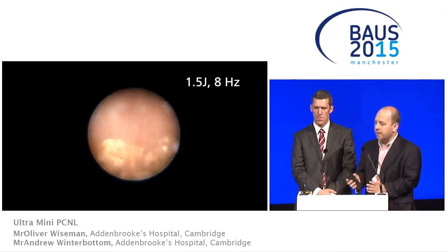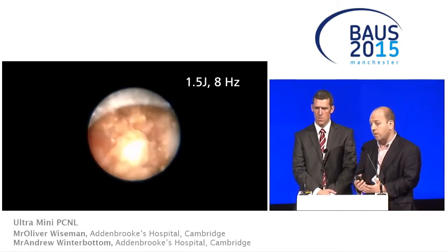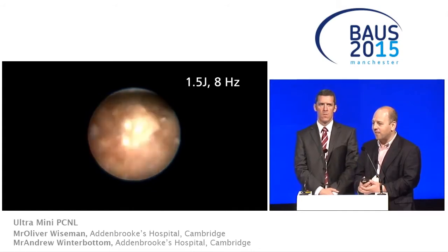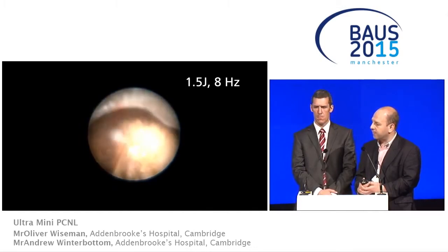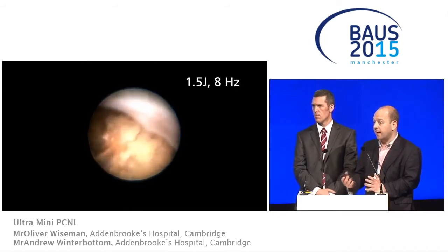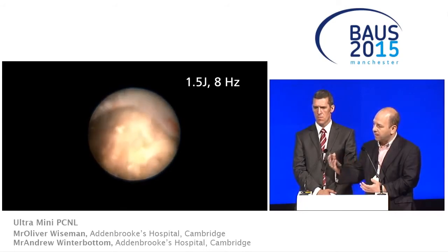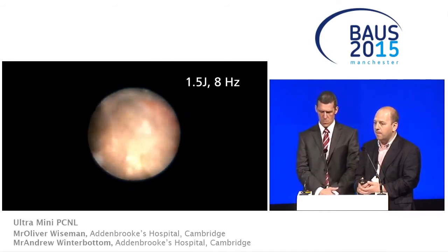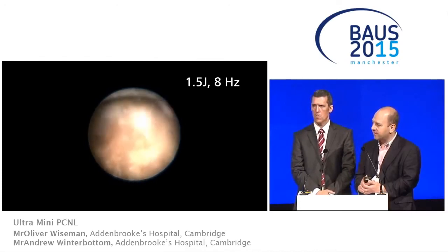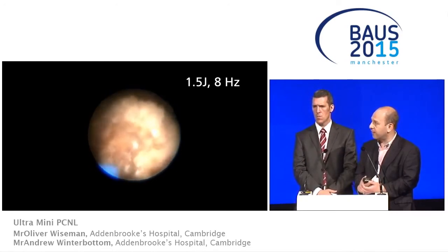And we know there is very good evidence that complications from PCNL are directly related to the size of the PCNL tract. So although the transfusion rate's low, I would suggest that if you can downsize your tract, it's likely that your complications are going to be lower. So I think it has significant advantages. In some particular stone cases it may be useful, such as stones in the calyceal diverticulum particularly. It may be useful in the paediatric population which Sharon showed as well, where obviously you don't want to use the bigger kit. I'm not suggesting for 1 minute that it would be the right operation for all stone cases, but I think it's certainly useful for the armamentarium, and there is very good data, as I say, that complications are directly related to tract size.